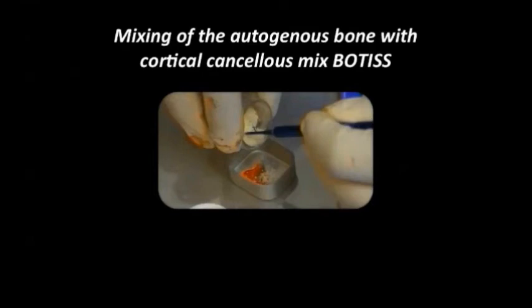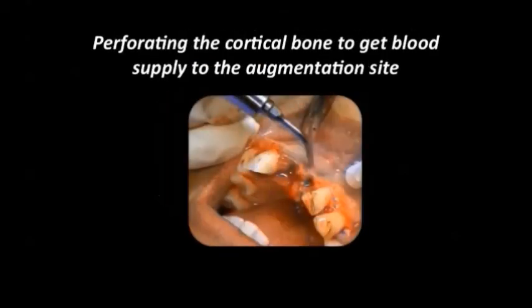You can use also the Zimmer bone, they also have the same structure. You can get a cancellous or cortical bone. I use the mix of both of them together. You mix it with the autogenous bone that has been harvested from the patient, and then we go back to the site.